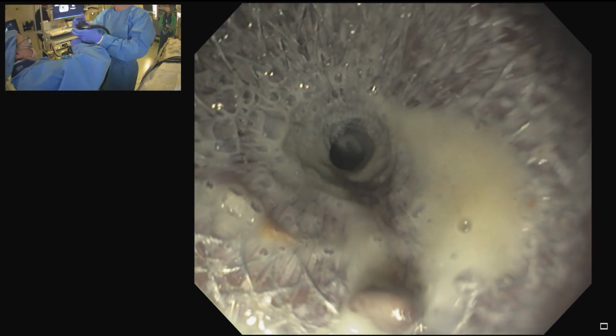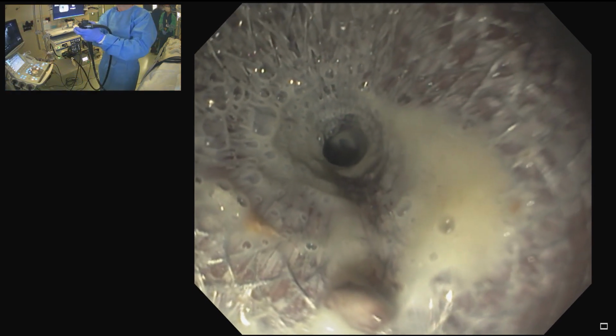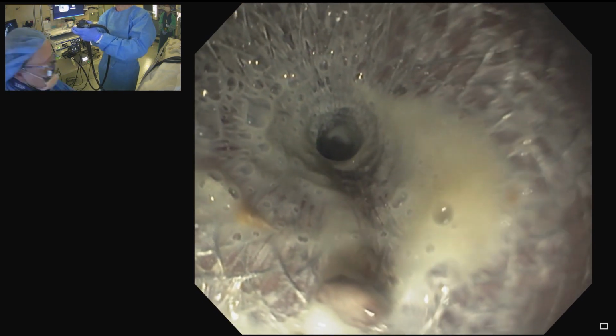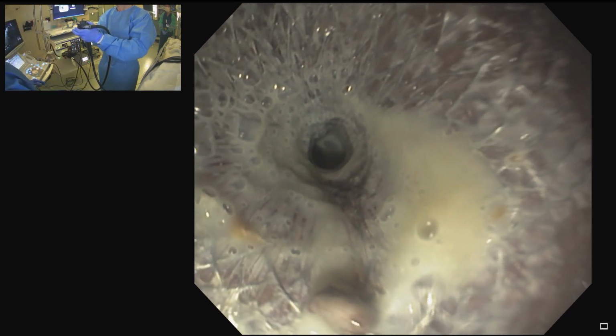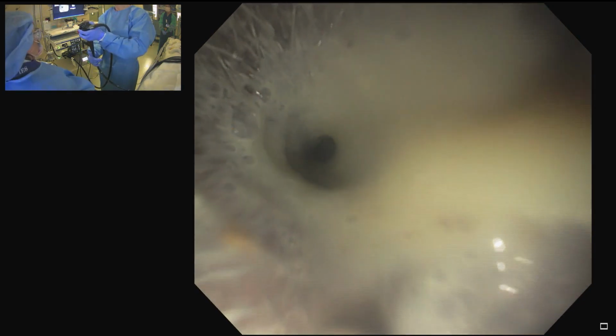But then, of course, after dilation, we'll have to switch out. Sorry to interrupt. We're going to break here. And if you're going inside the collection, we may be able to come back, but they're waiting for us in Guayaquil. Okay, we'll keep an eye on what you're doing, and we might come back. Thank you very much for this demonstration. Yeah, it looks beautiful.